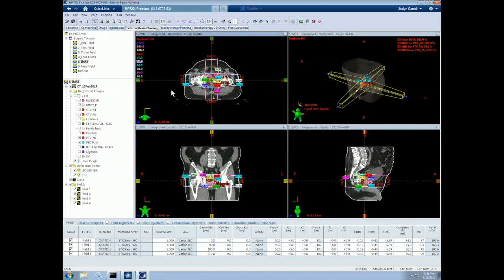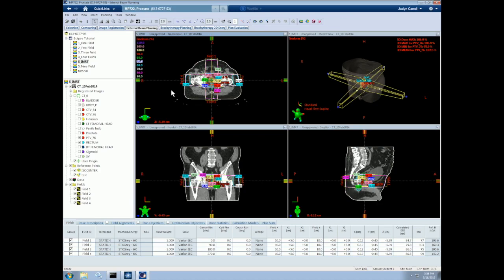Let's start with the four-field box plan that we learned how to create in the last video and convert it into an IMRT plan. We will work with the same anonymized patient as we used in the last video. For an IMRT plan, we still need to define the gantry, couch, and collimator geometry for each beam, but the fluence in each beam is optimized by the treatment planning software. IMRT stands for Intensity Modulated Radiation Therapy.